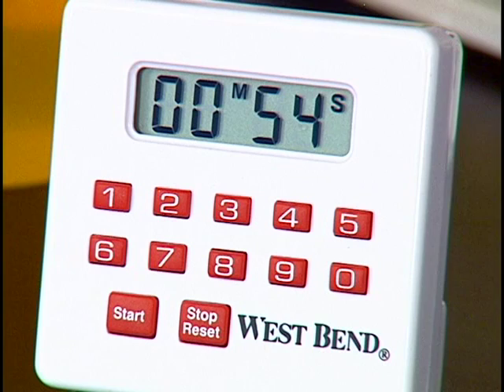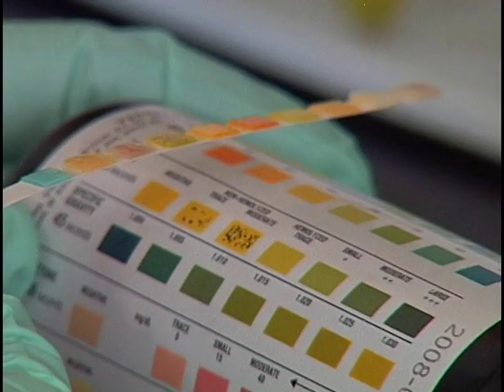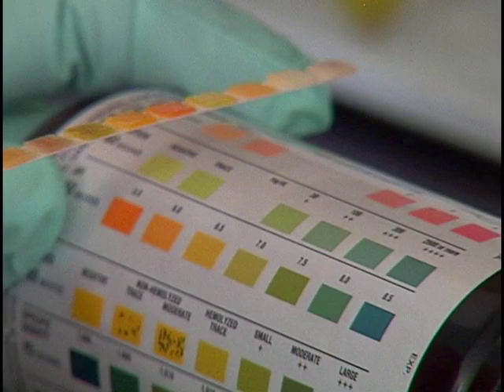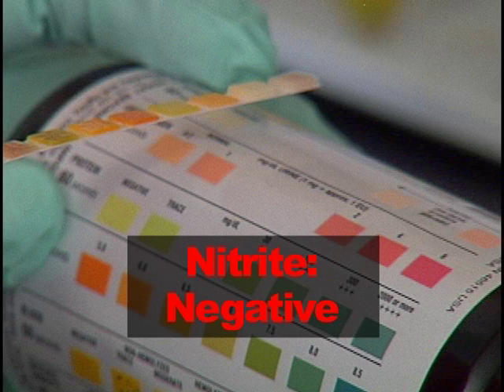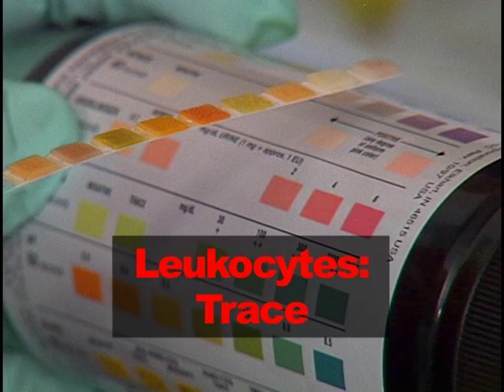Blood, pH, protein, urobilinogen, and nitrite are all read at 60 seconds or 1 minute. The result for blood is negative. The result for pH is 5. The result for protein is trace. The result for urobilinogen is normal. The result for nitrite is negative. Read the results for leukocytes at 2 minutes. The result for leukocytes is trace.